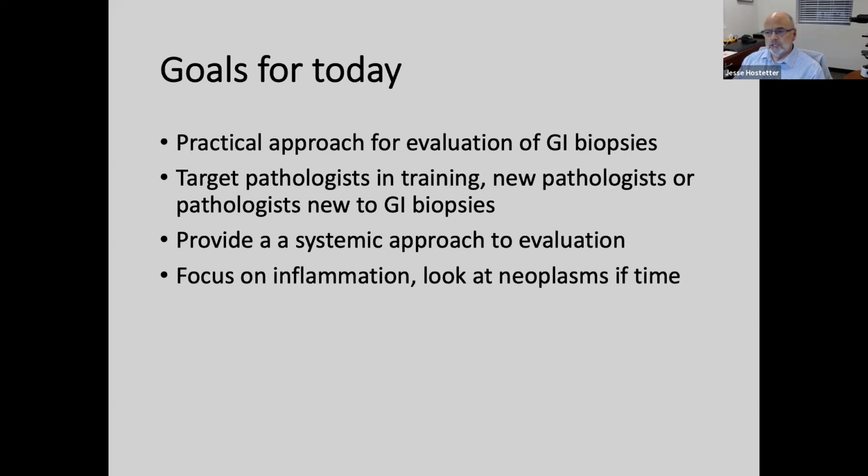We'll think about some systematic approaches that you can apply to all of the biopsies. We're going to focus on inflammation, and I'm going to try to go for an hour and a half. If we have some more time, we'll talk a little bit about neoplasms. At the end of an hour and a half, we can answer any questions that you might have. If you have questions before then, just send them into the Q&A, and I'll try to answer them as we go along.